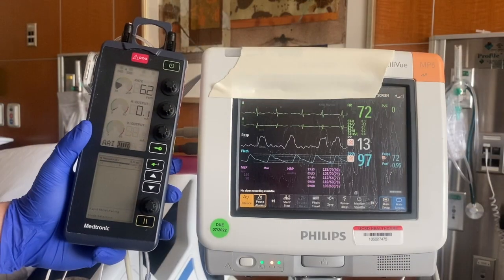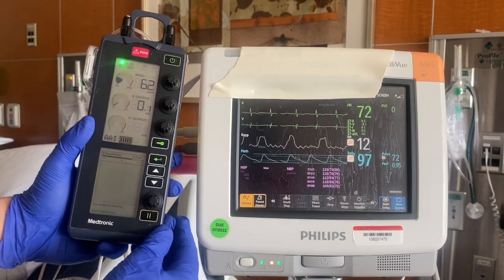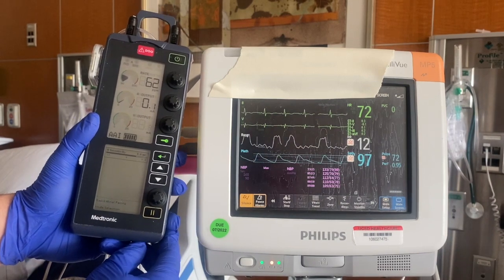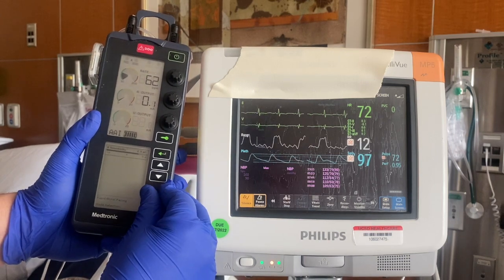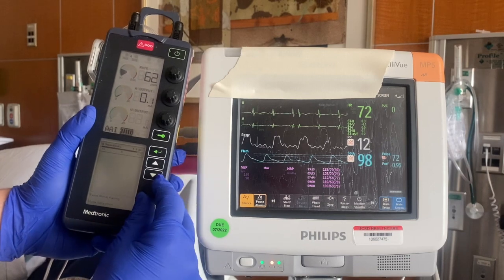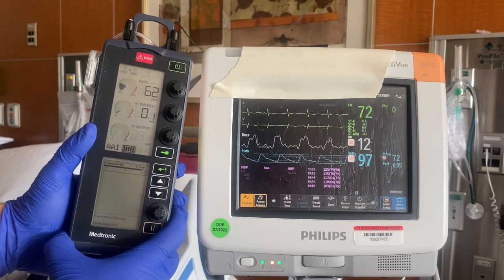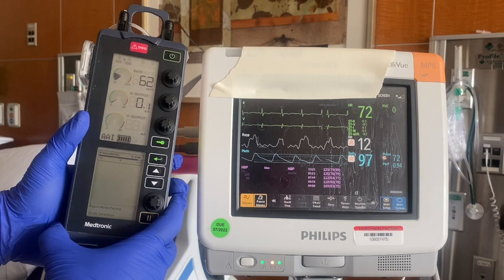This will be your sensitivity threshold — it is currently at 3 millivolts. To set your threshold value, you will cut that in half; in this case it will be 1.5 millivolts. There is only a 1.4 setting, and this will be adequate for your sensitivity threshold value.